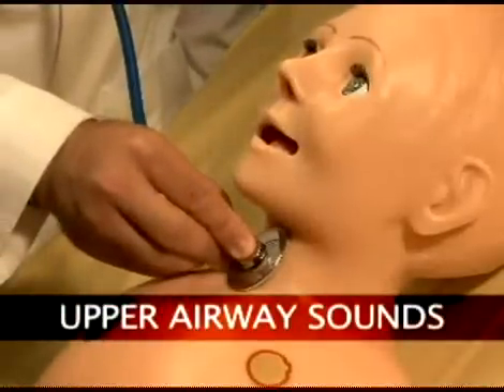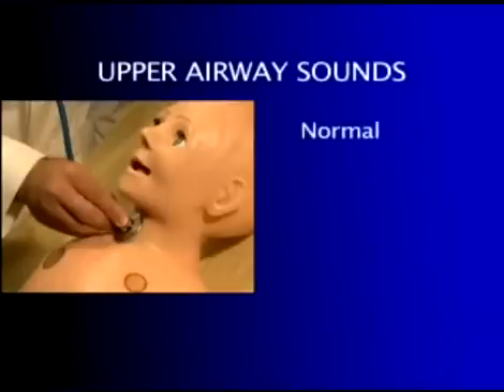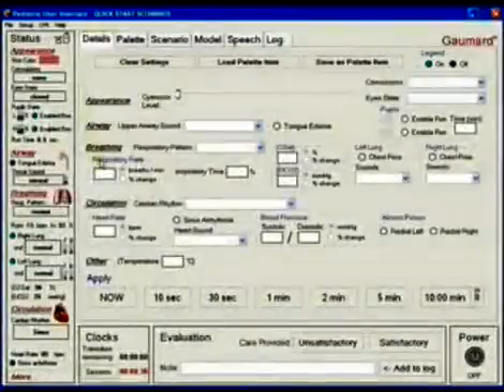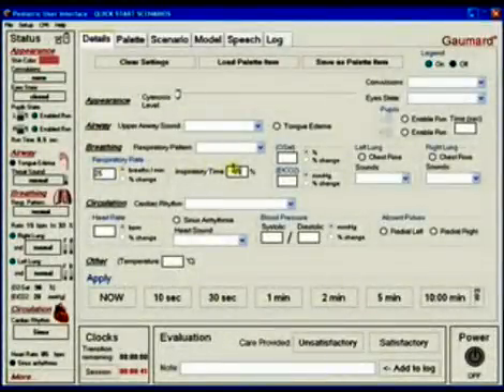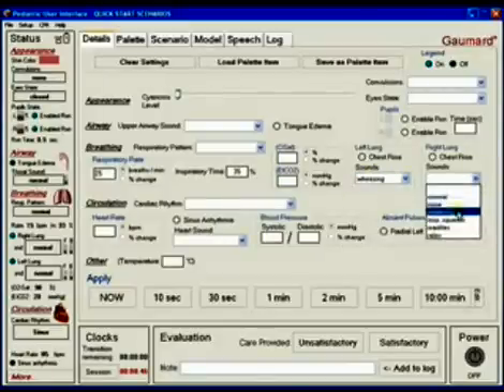Users can perform a tracheostomy procedure during a difficult airway scenario. Pediatric HAL has multiple upper airway sounds synchronized with his breathing. Users can easily control rate and depth of respiration, and choose independent left and right lung sounds, which are synchronized with selectable breathing patterns. Multiple sounds are available.